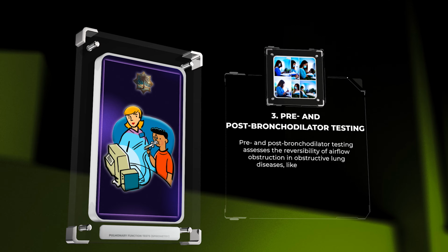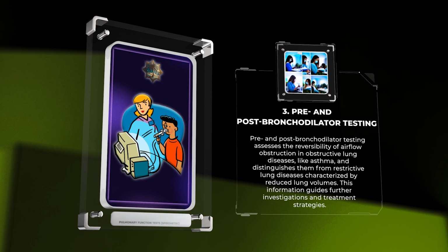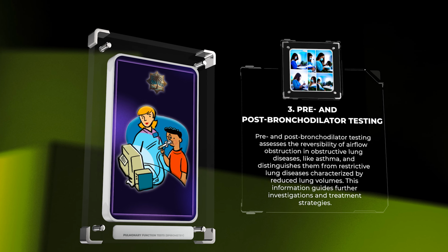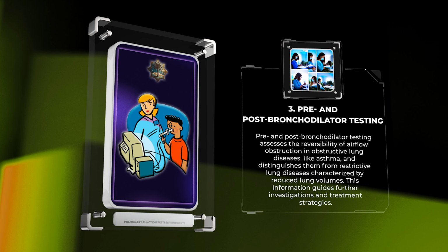Pre- and post-bronchodilator testing assesses the reversibility of airflow obstruction in obstructive lung diseases, like asthma, and distinguishes them from restrictive lung diseases characterized by reduced lung volumes. This information guides further investigations and treatment strategies.